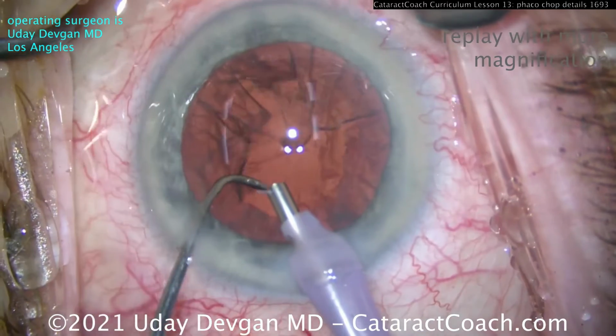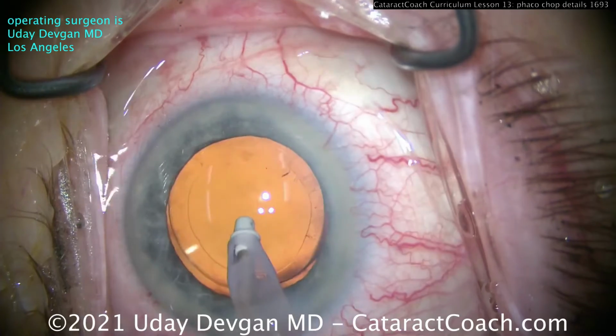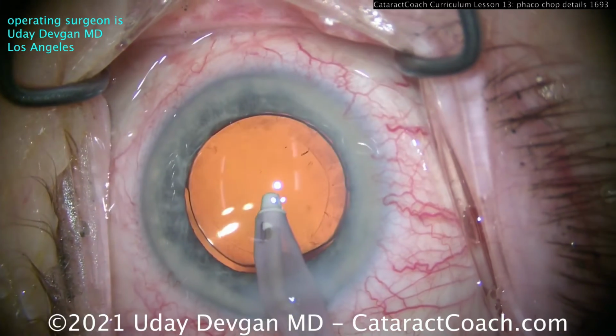You can certainly learn this. It's just not that hard. Let me fast forward to the end of the case here and show you what it looked like. And now you can see there's the rhexis.